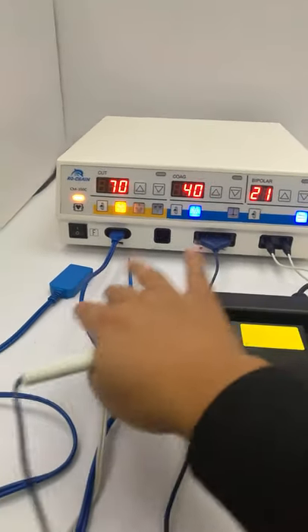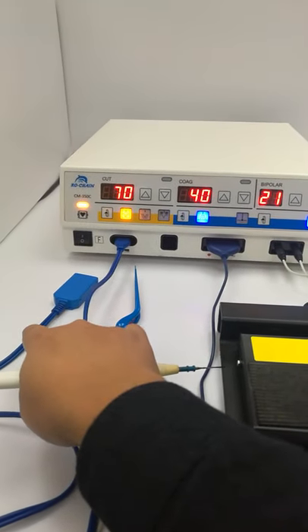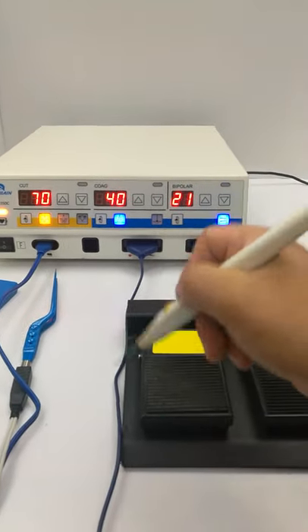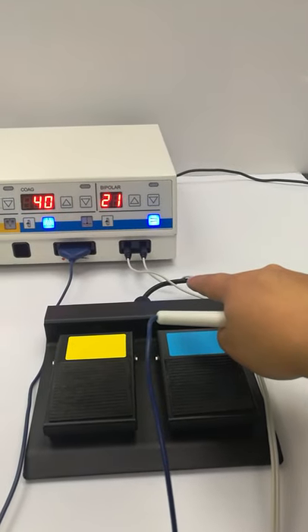You can see all the standard accessories here: patient plate, cable and plate, bipolar forceps, and this one is hand pencil, and this one is bipolar forceps.